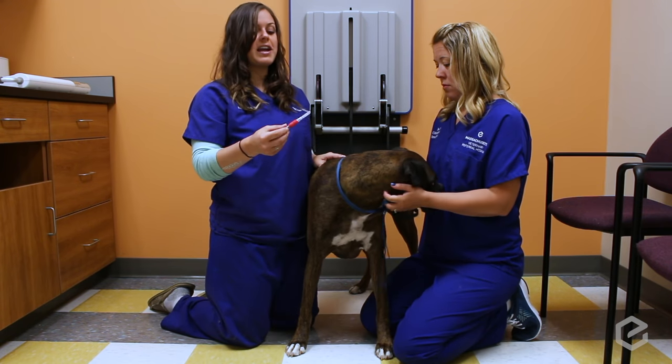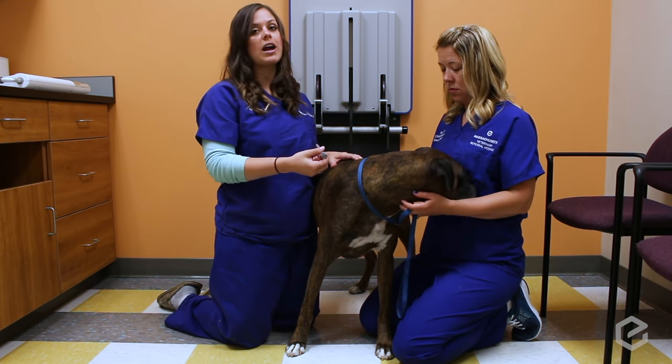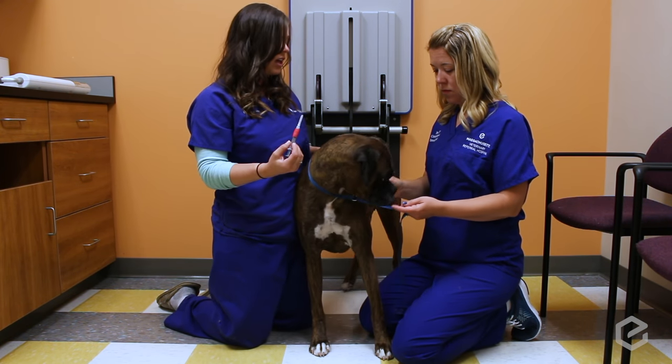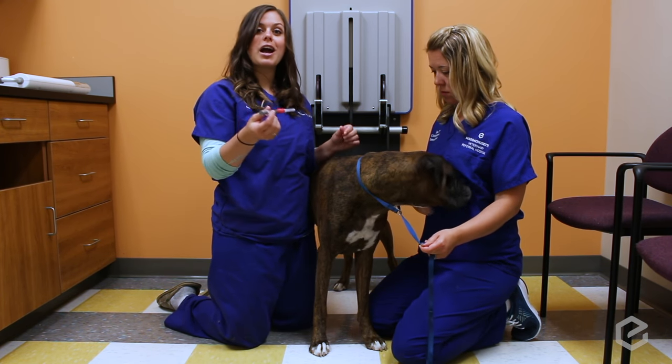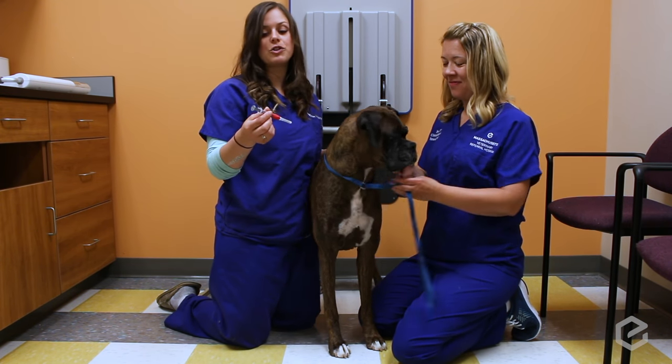It doesn't matter which way you point the needle — it can be towards their head or away from their head, whatever you're more comfortable with. It's just important that you don't poke yourself, so make sure you go in at a 45-degree angle.